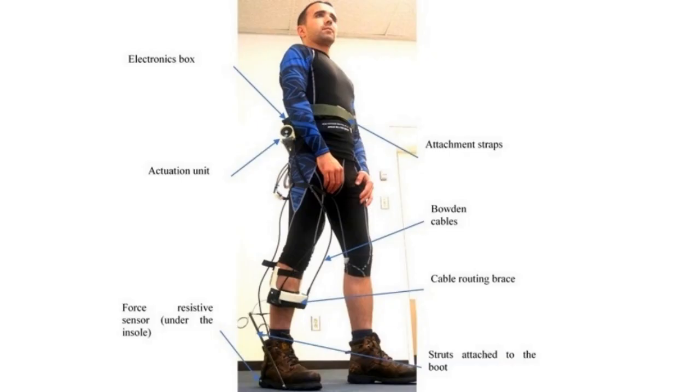Our exoskeleton, WAXO, as we named it, is composed of an actuation unit attached to the waist of the user, a transmission system based on bowden cables, and a strut assembly fixed to the boot, in addition to the electronics and control system.